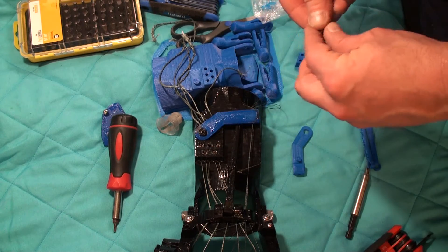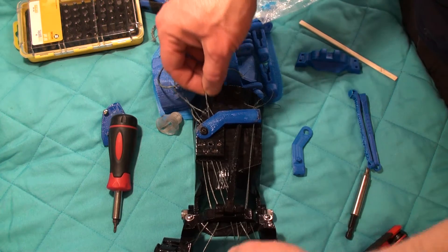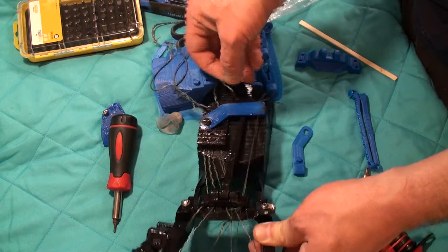It bites right into the plastic here, and you can see now that this cable for the middle finger is now loose.